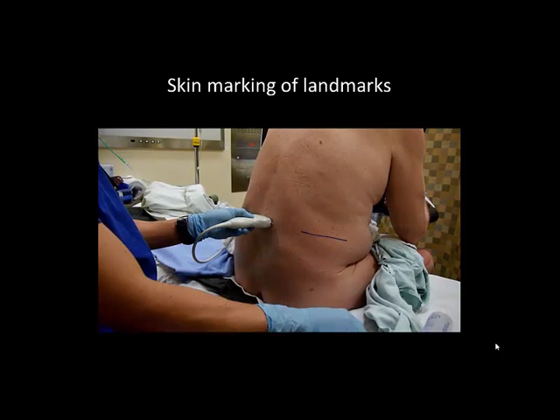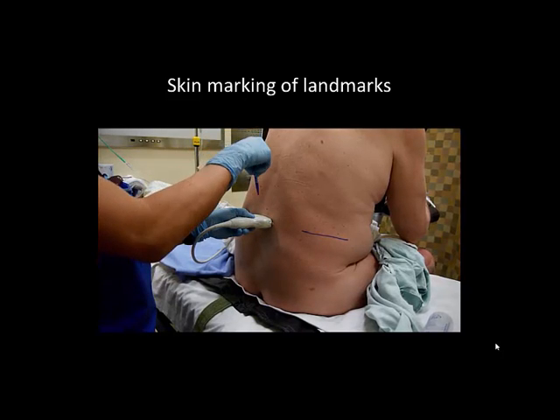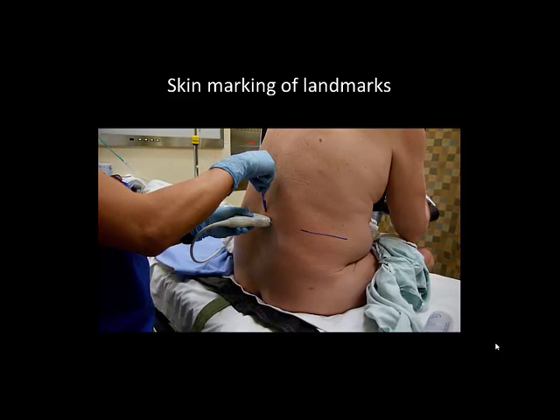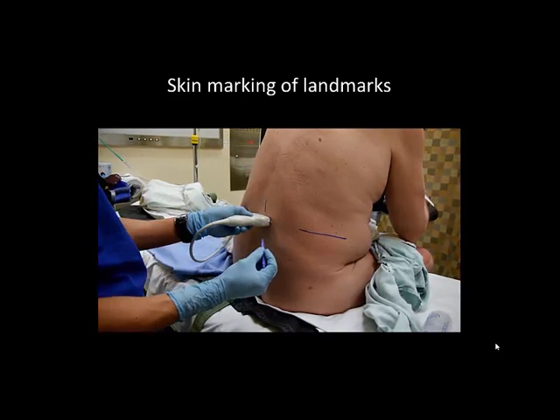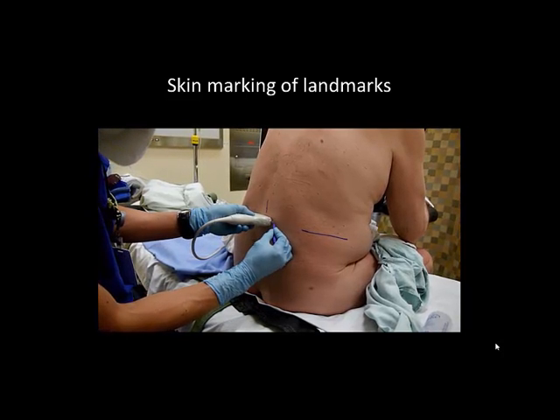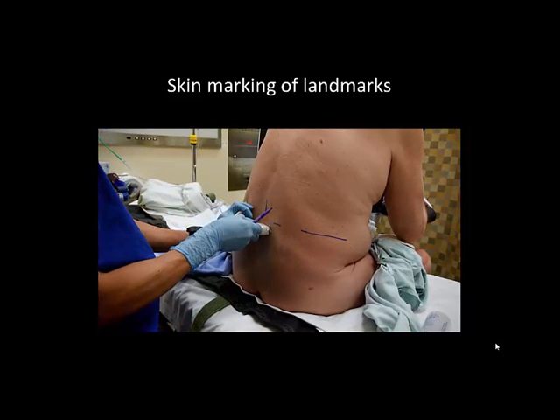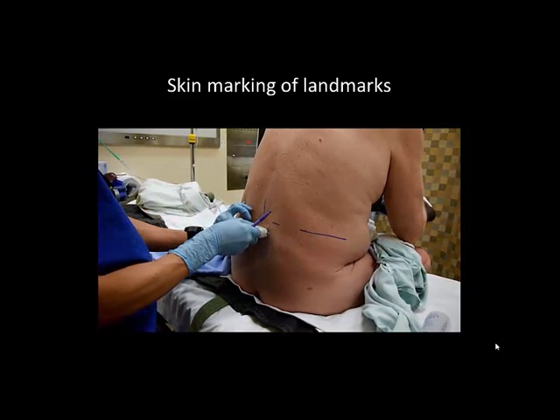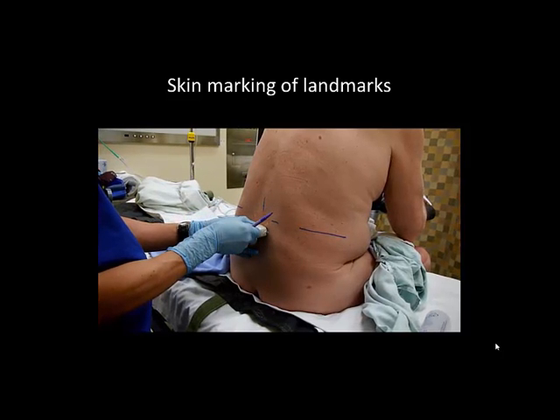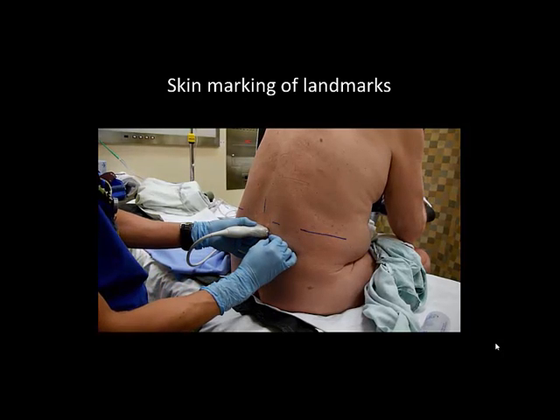The probe is held steady and any gel should be cleaned off thoroughly before attempting skin marking. The midpoint of the long edge of the probe is marked to indicate the location of the neuraxial midline. The midpoint of the short edge of the probe is marked to indicate the location of the spinous process. The scanning and marking process is repeated for at least two adjacent spinous processes.